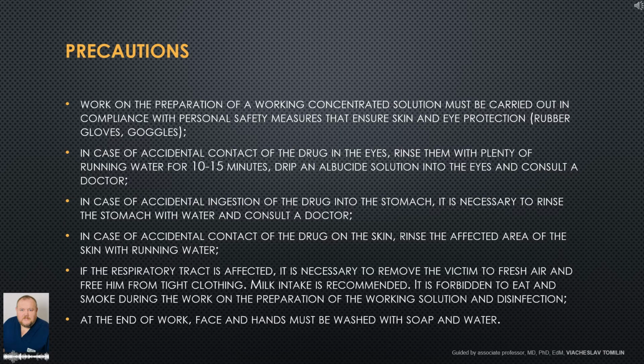Precautions. Work on the preparation of a working concentrated solution must be carried out in compliance with personal safety measures that ensure skin and eye protection: rubber gloves, goggles. In case of accidental contact of the drug with the eyes, rinse them with plenty of running water for 10 to 15 minutes, drip an albucid solution into the eyes and consult a doctor.